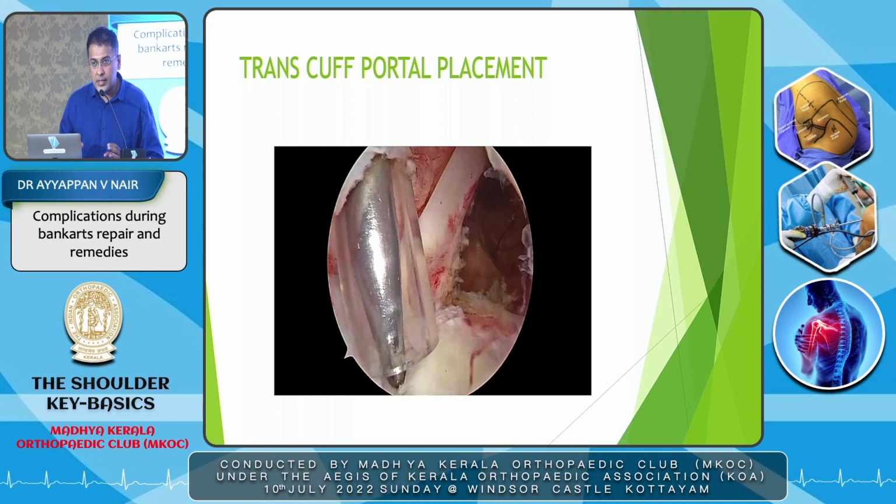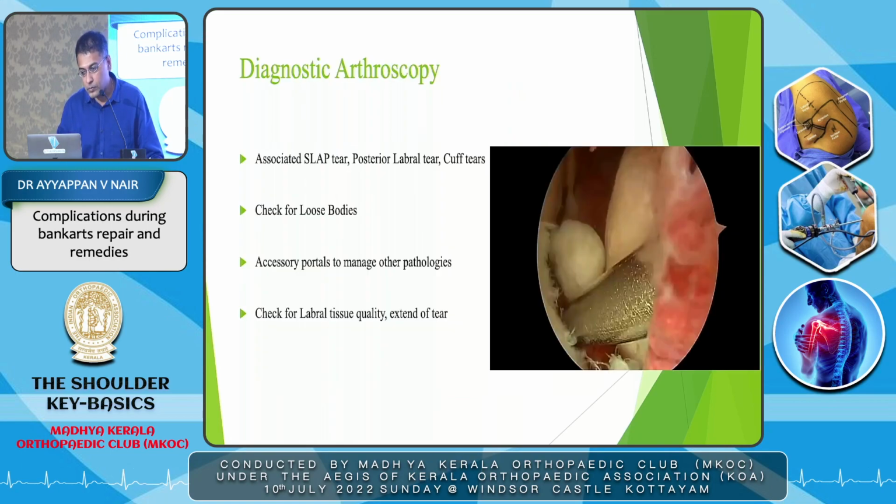So the thing is, don't waste your time. You can do a diagnostic also, but if you're a beginner, don't waste your time, because when you're going around and coming back, there are chances that the posterior port is going to come out. So put in your anterior port, and then you can do your diagnostic later. If your anterior is there, don't worry, you can always put a posterior port again.